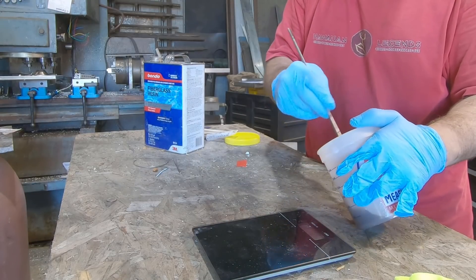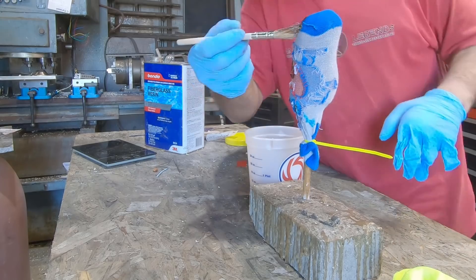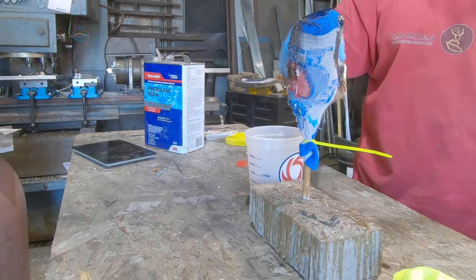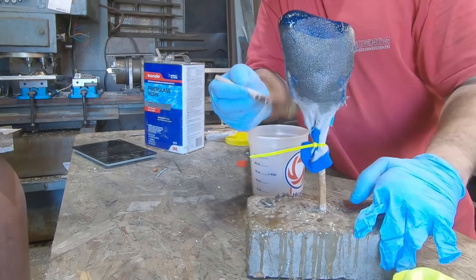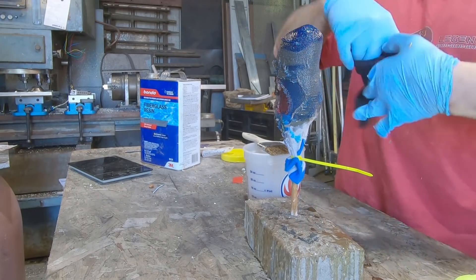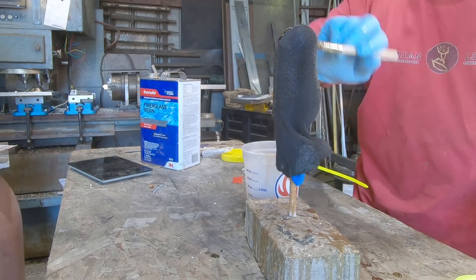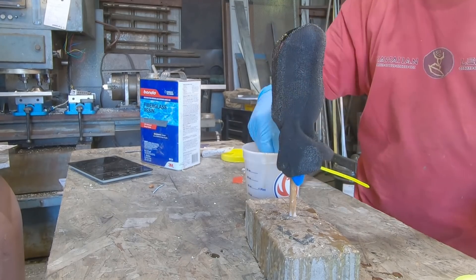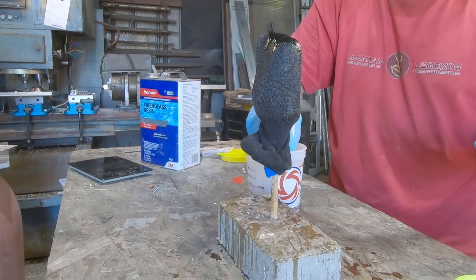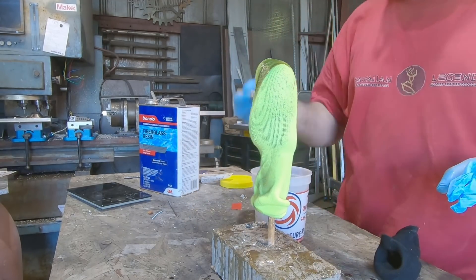Mix in the catalyst and stir it well, making sure to mix all the way to the bottom and all the way to the edges of the container. Start at the top and evenly coat the entire model, making sure the entirety of the sock is thoroughly saturated. After you're confident it's coated well enough, go ahead and don the second sock. Be aware of the toe seam and the alignment of the sock — try not to spin or twist the sock as you're stretching it over the mold. The heel of the sock goes towards the back of the hand and the toes align with the plane of the metacarpals. Continue to lay up the socks and paint on the resin until you either run out of socks or run out of resin.